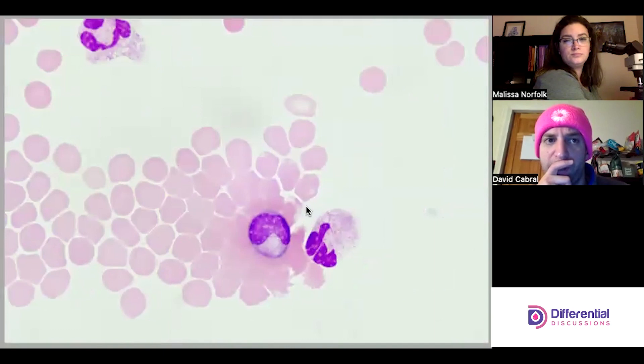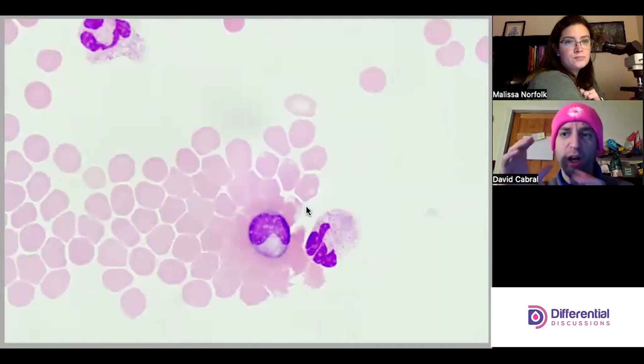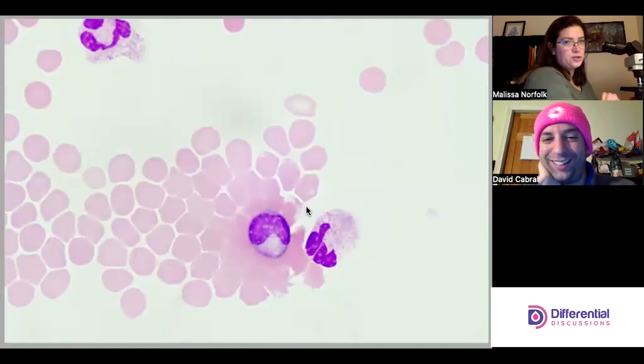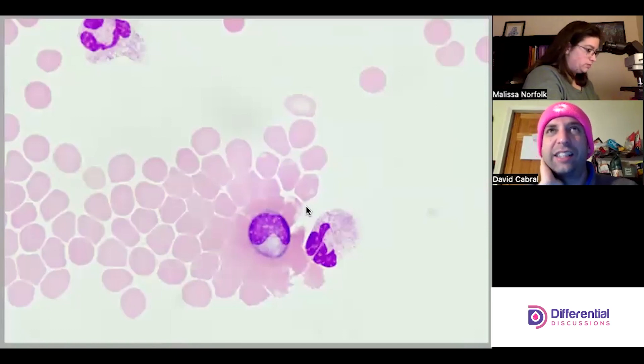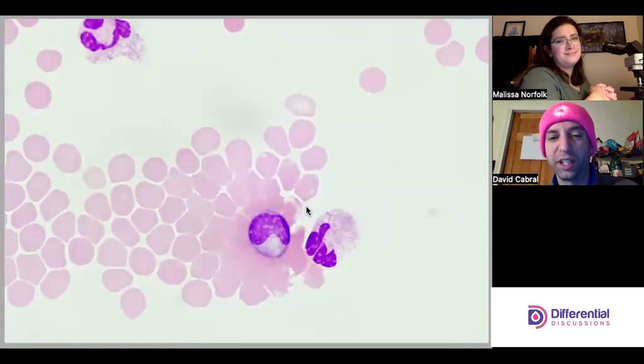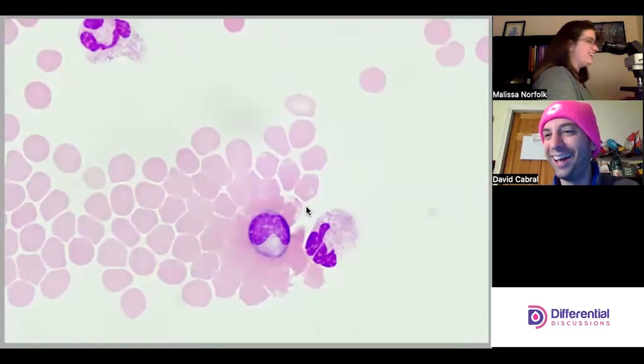An immature granulocyte is visible. SOPs can vary — some institutions broadly categorize as 'immature gran,' while others enumerate metas, myelos, and pros. This one looks like a metamyelocyte. On a cytocentrifuge classification can be tricky because cells can be distorted in a way that makes it harder to classify, and you're not going to see a very nice Golgi apparatus.